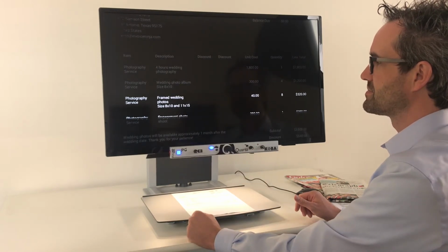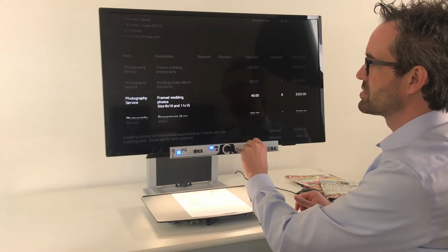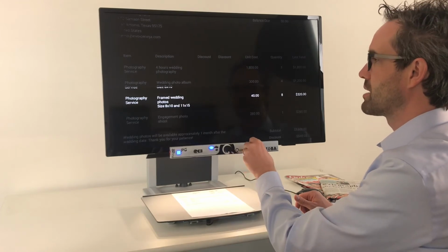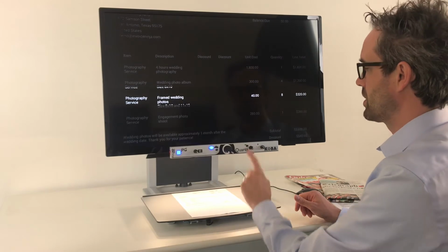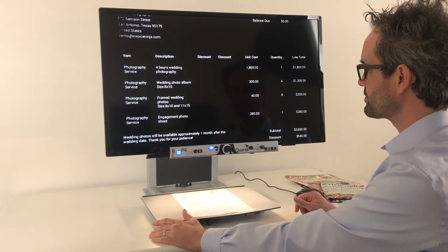Press and turn to set width. You also can change the position of the bar up and down by turning the button, and by pressing and turning at the same time, you can change the width: smaller, wider, smaller. If you press again, no bar or line. You're back in the normal view.